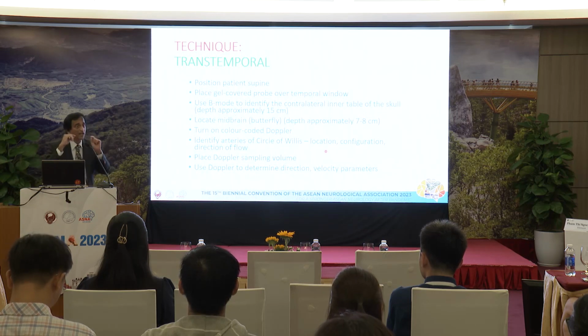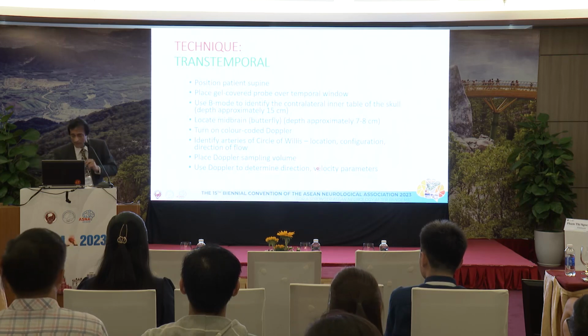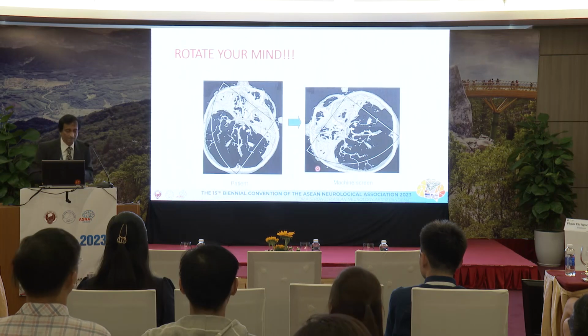Having found the arteries, you know where you are, you then put the sample volume and look at the velocities. As you heard earlier, the systolic, diastolic, all will be revealed to you. By using Doppler, you can then determine all the required parameters.